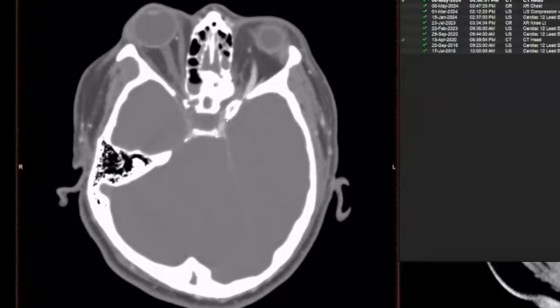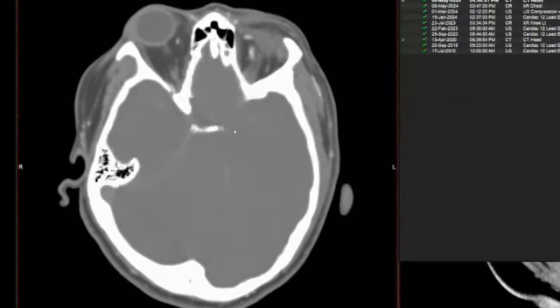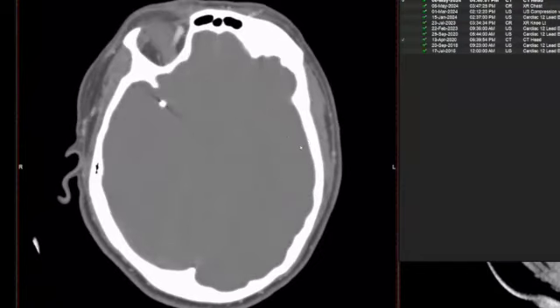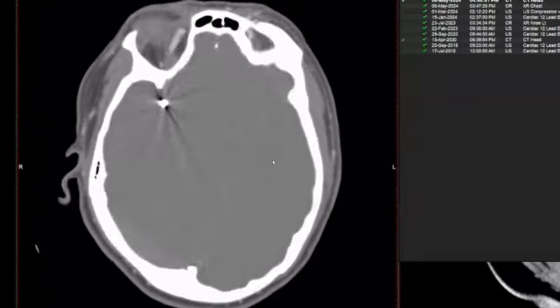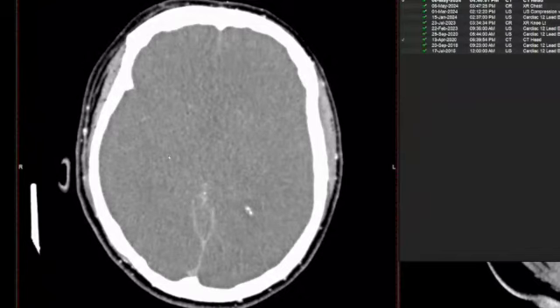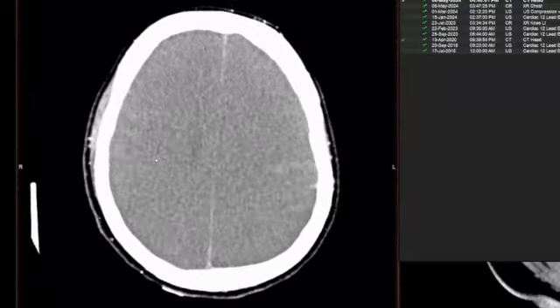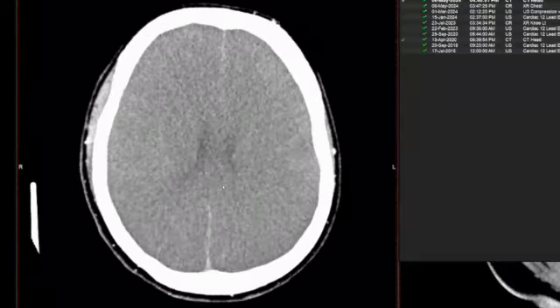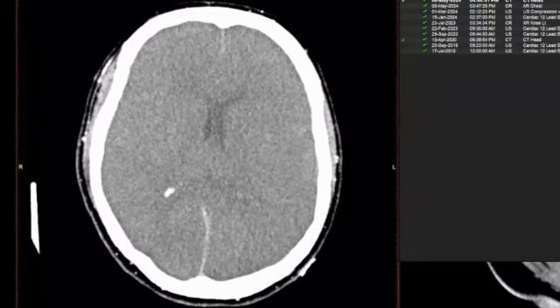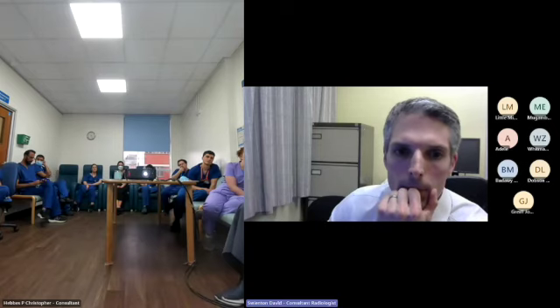And on the left, you can see that, in fact, there's some contrast making its way. It nearly gets beyond the dura, but not quite. So as you pierce the dura, this becomes the terminal carotid, and the middle cerebral artery, there's no opacification. Again, we don't do many of these, but thankfully I've not encountered one where we've got contrast that goes much beyond the intracranial components, so you can be pretty certain. And again, looking at the M4 cortical regions, there's absolutely no suggestion of opacification there. And then scrolling down to the ICVs, absolutely nothing. So again, this was another test that was pretty unequivocally supportive of brain death.